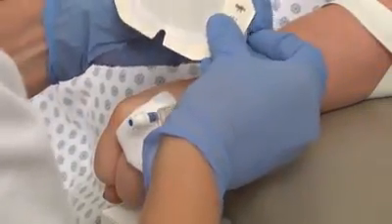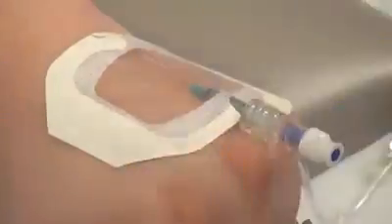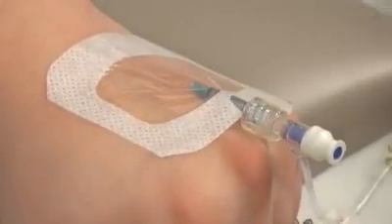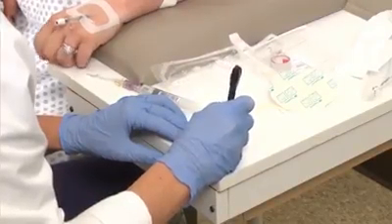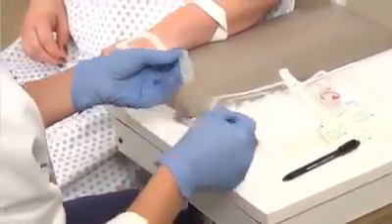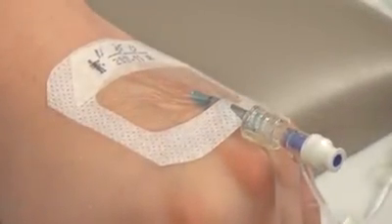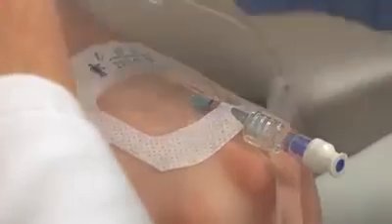If there is no swelling or pain, secure the angiocath with a transparent dressing. Once the angio is secure, you can fill out the date and time sticker. Remember to do this before affixing it to the dressing. When applying the sticker, place it so the insertion site can be seen and assessed. Secure with tape as needed.